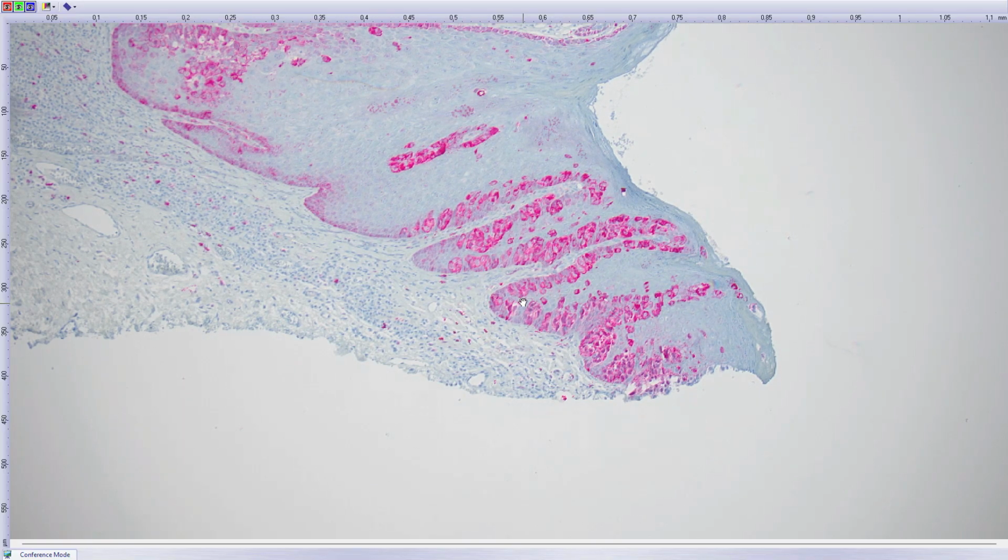That means Paget disease that must usually start from anogenital glands in the vulva, yeah. What is the message of this lesion? The message is that if it were only that squamous cell carcinoma you have on the vulva, you excise all invasive lesions.